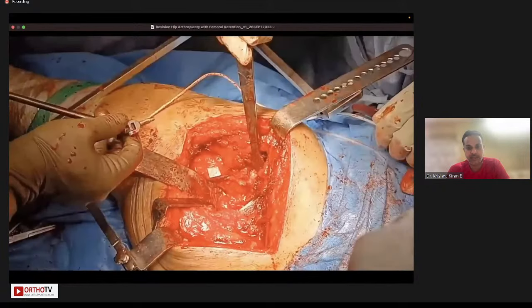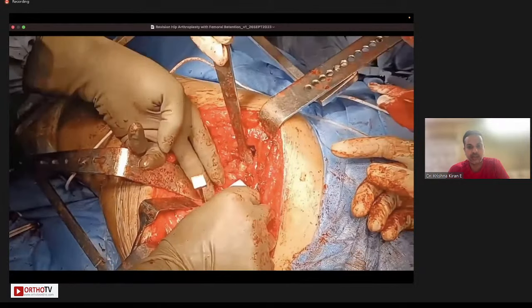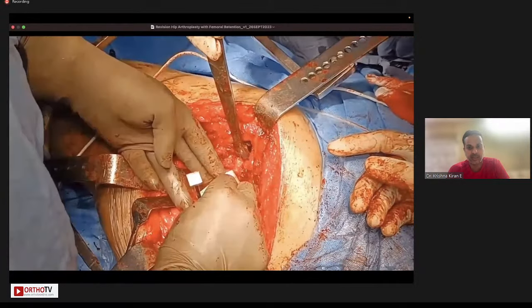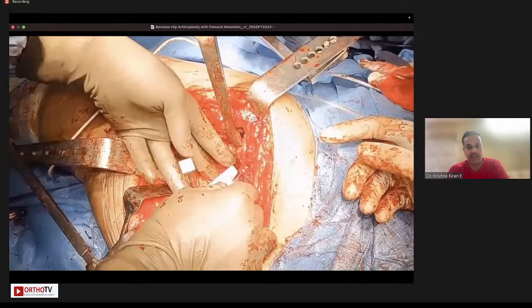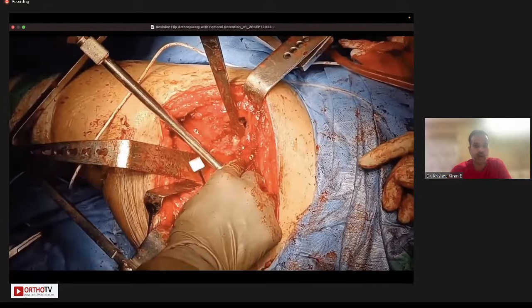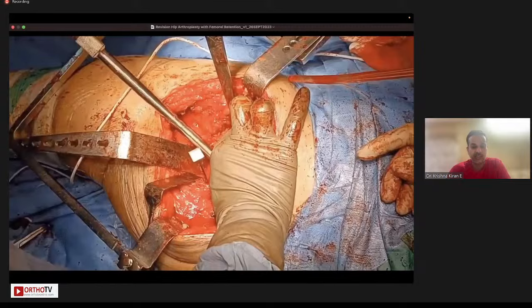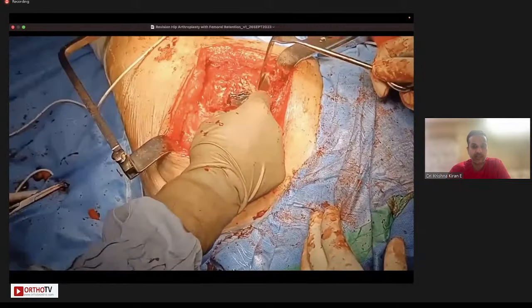Now, once the acetabulum is deemed stable in the correct inclination and version, then you position your liner. And typically, I tend to use a lip liner in revision scenarios using a highly cross-linked polyethylene. So you can use a 4 mm lateralized and a 10 degree lip liner in these situations, because one of the most common causes for failure in revisions is the instability.